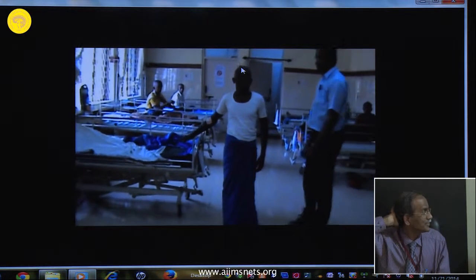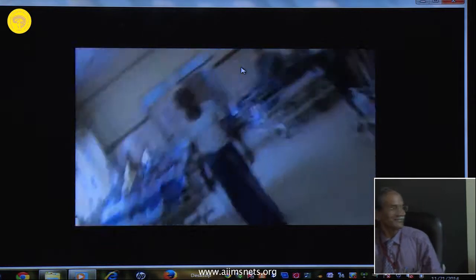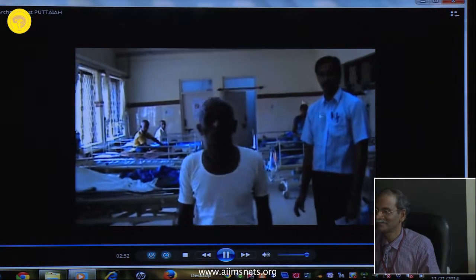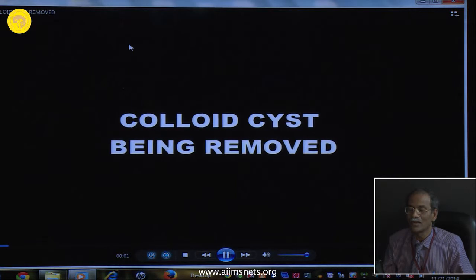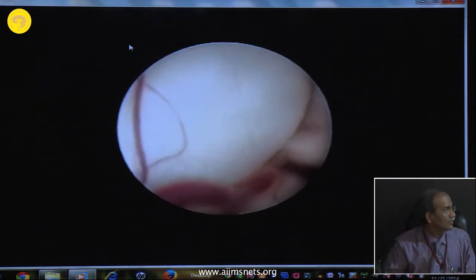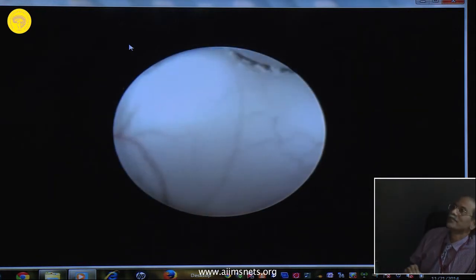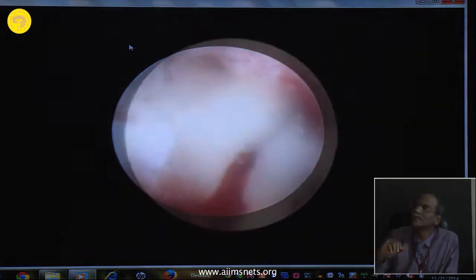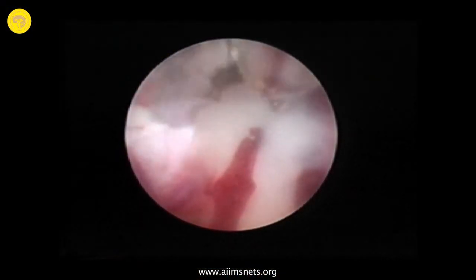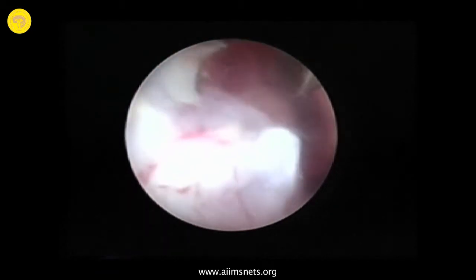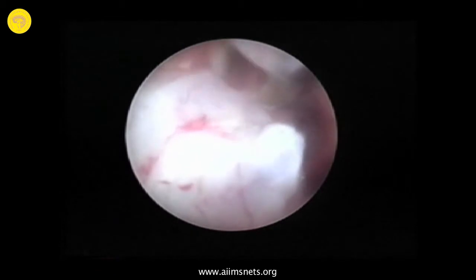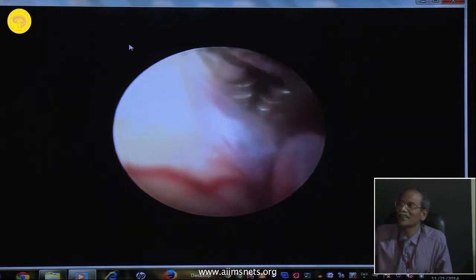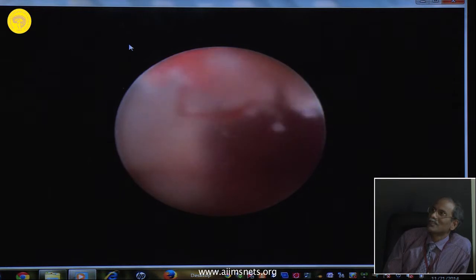Following surgery, the patient developed ptosis, which subsequently improved. Not all colloid cysts are easy to excise — they give a lot of problems when situated posteriorly. Sometimes you may get fluid; sometimes the colloid material itself is very solid. See the blood vessels — how they protrude into the cannula. That is the last part of the cyst being taken out.